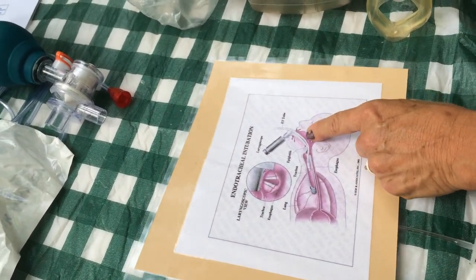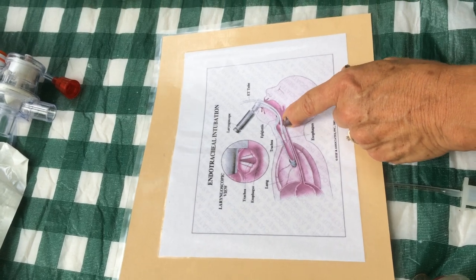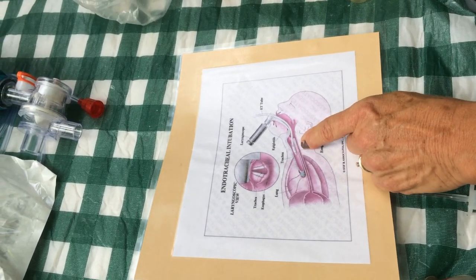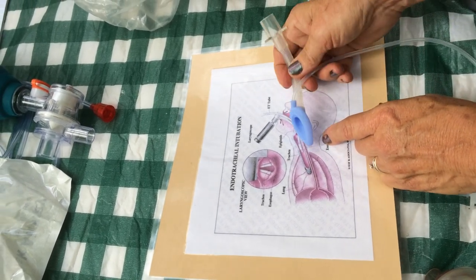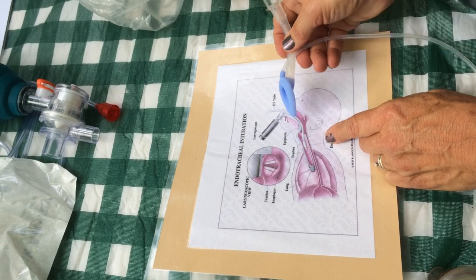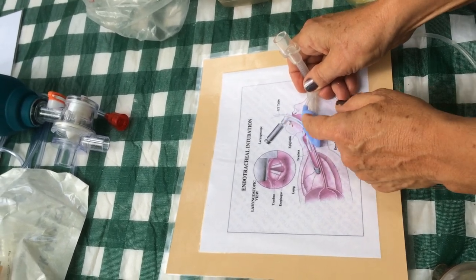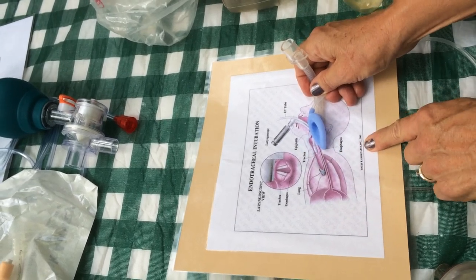So, when we did the laryngoscope and put in the ET tube, what we were doing is going into the trachea and making sure no more air was going to go into the esophagus. What this effectively does is it closes off the esophagus and allows you to bag mask the baby's lungs only. Does that make sense?